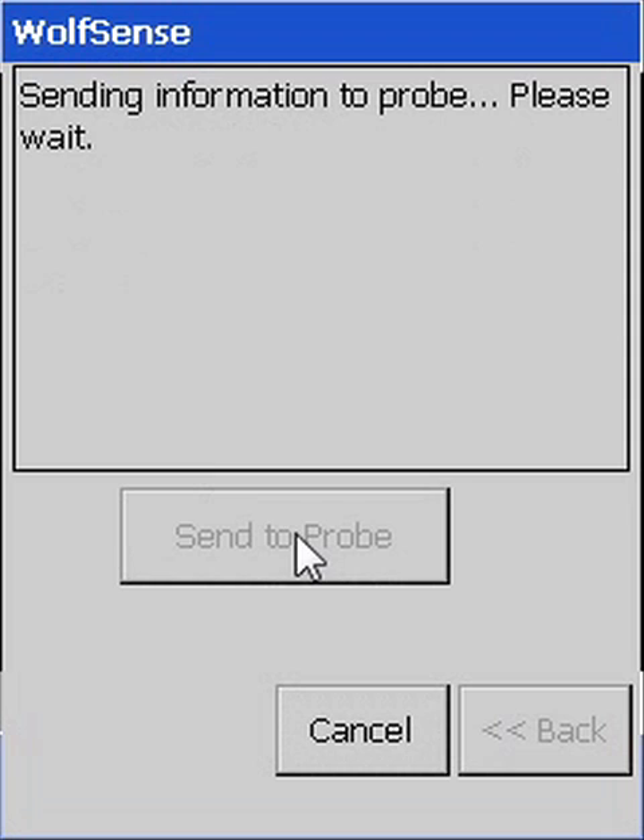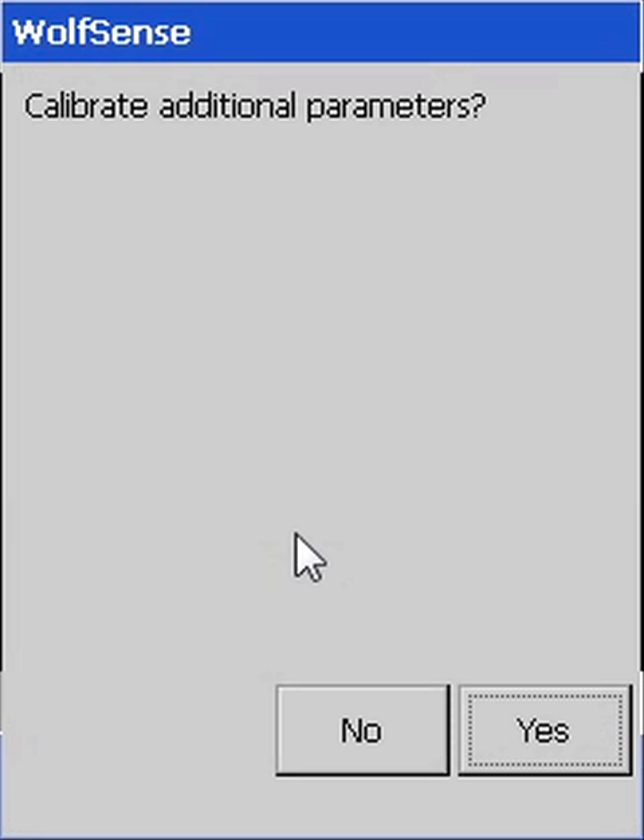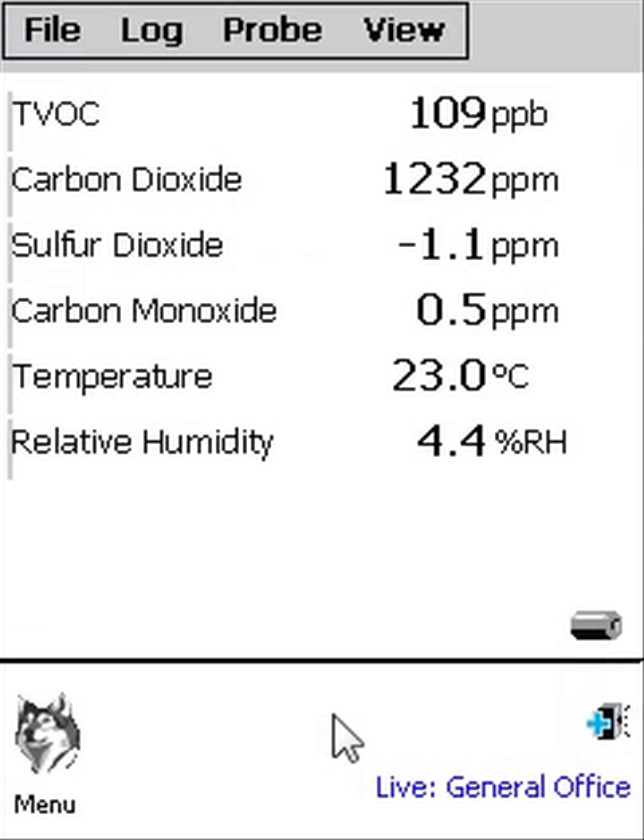If you feel you may not have calibrated properly, select Cancel and try again. If you want to calibrate additional sensors, click Yes. For this example, we are finished and end up on the live reading screen. Feel free to contact Graywolf if you have further questions.